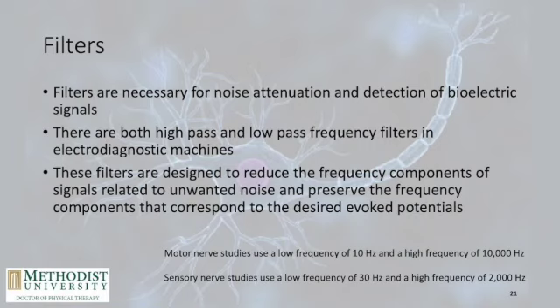A filter is going to be necessary, and the reason is because we're going to have a lot of other noise. So really what we're trying to do here is filter out the signal and filter out the noise. So a filter is just going to work like an old style radio. Okay, so what we're trying to do is filter out all the static and get the signal that we really want out of these studies.